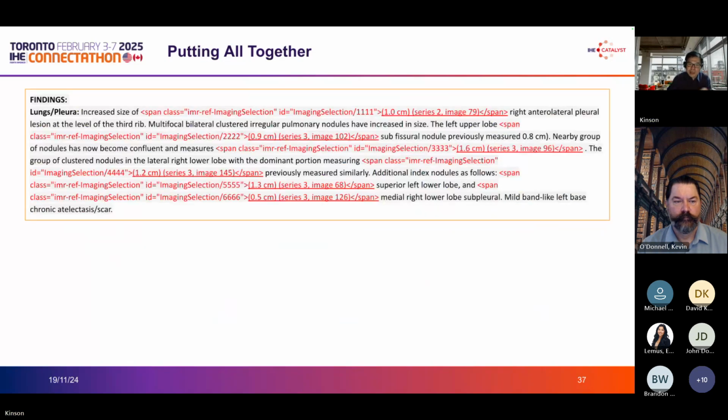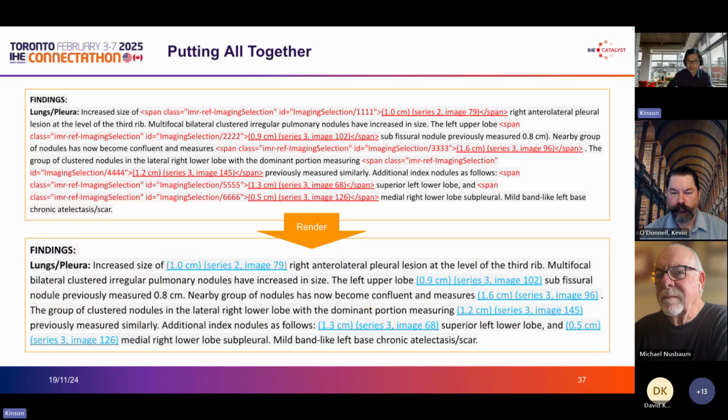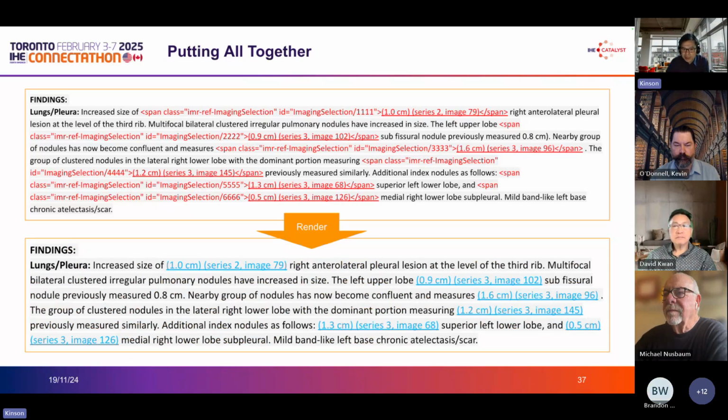And with that real-time integration, now it is much easier for the reporting system to inject all those rich contents in the report directly, because in the past that was complicated, since the two systems didn't have real-time data sync. And now with that rich information, a viewer, a renderer, can read the report and render it with hyperlinks and let the user use the report much more easily with much richer content.